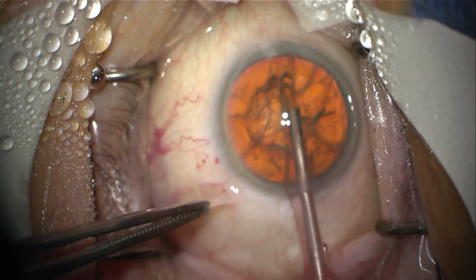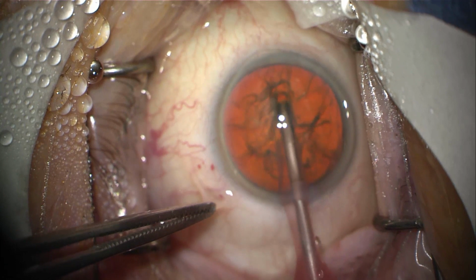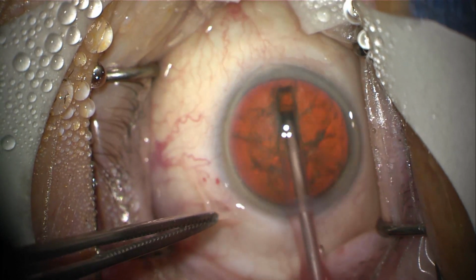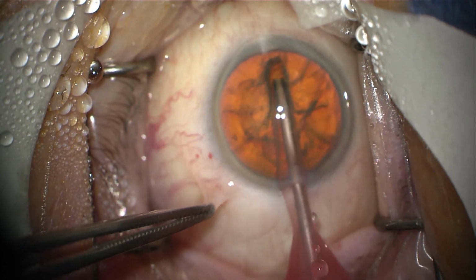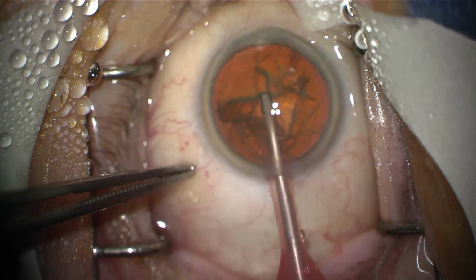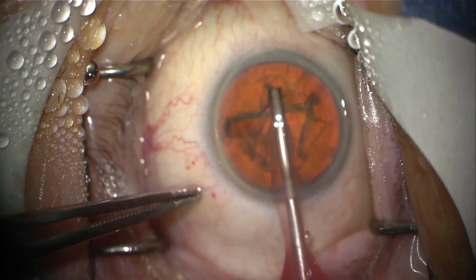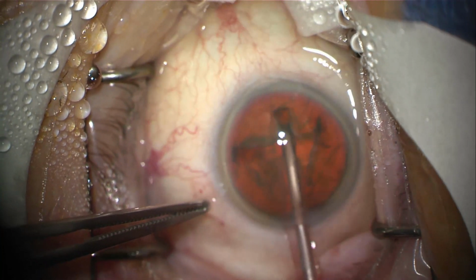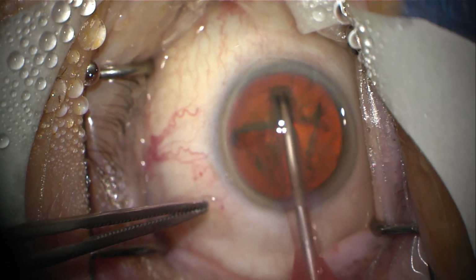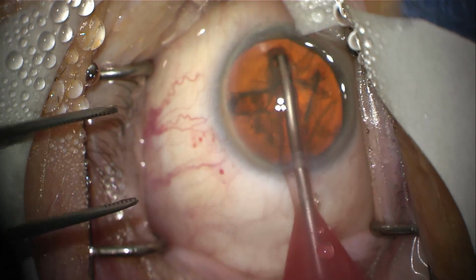I'm converting the dense, solid cataract into a liquid, and then I'm vacuuming it out through the opening of this vibrating metal tip. And then I rotate the cataract approximately 90 degrees, and I make another groove or incision. This is called sculpting of the cataract. It's removing the chocolate from the M&M without damaging the candy shell.